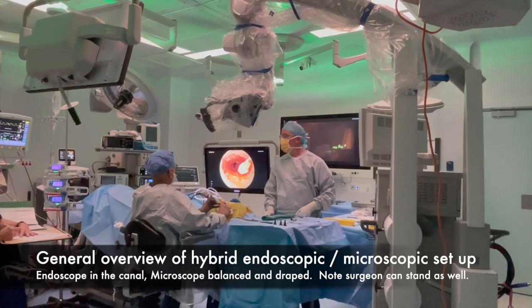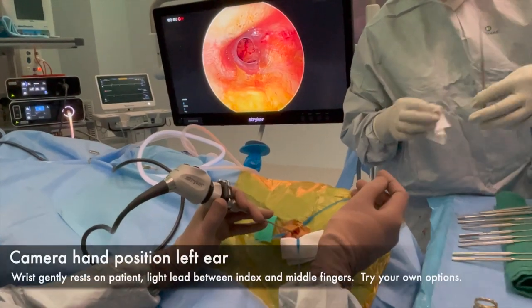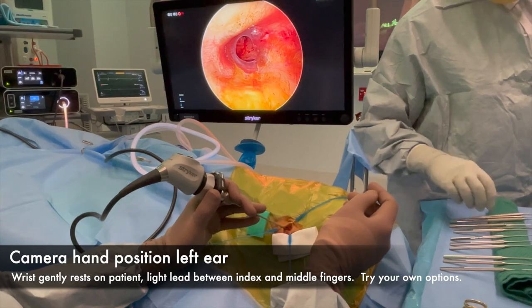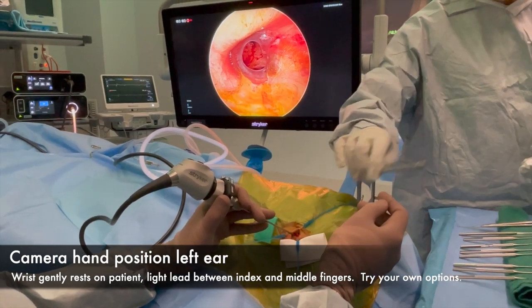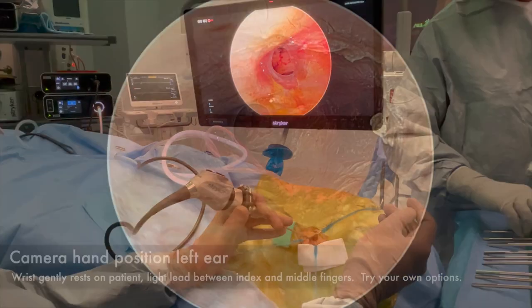Here is the final general overview for a hybrid endoscopic-microscopic setup, with the microscope always balanced and draped. The light lead goes up between my index and middle finger — try different options when you're beginning endoscopic ear surgery.